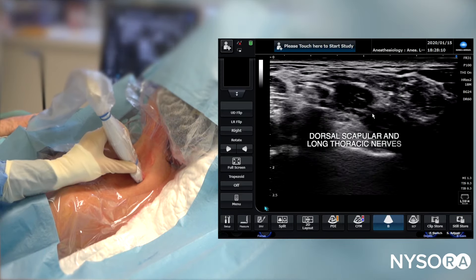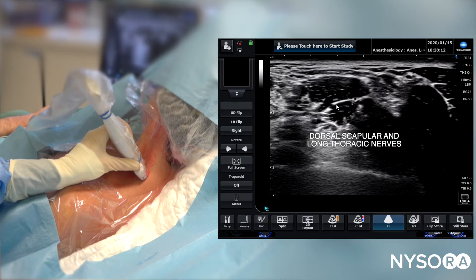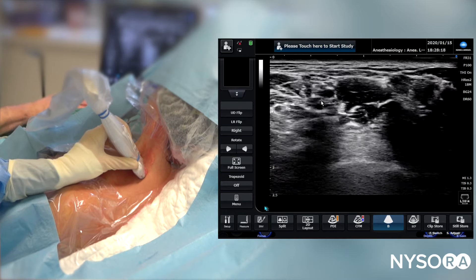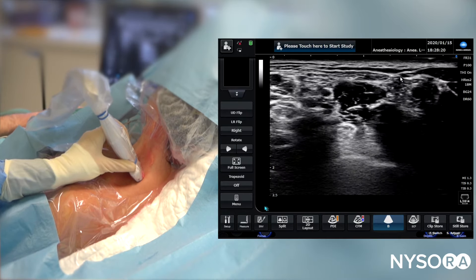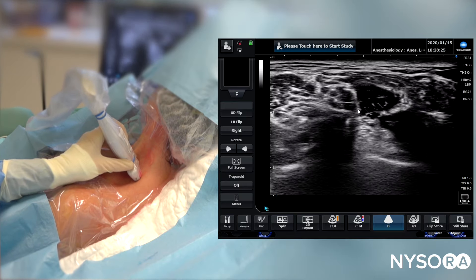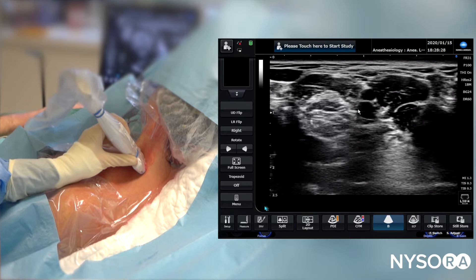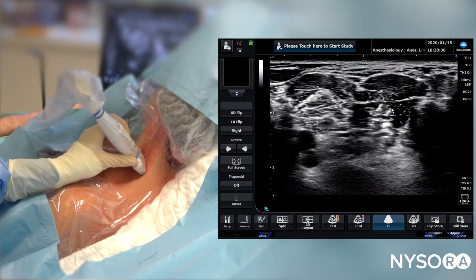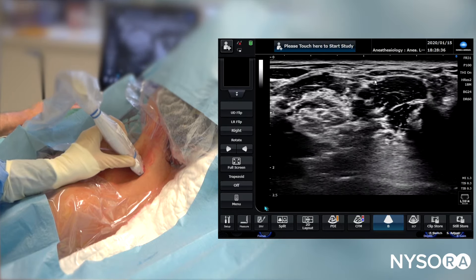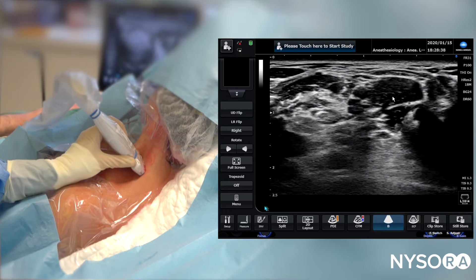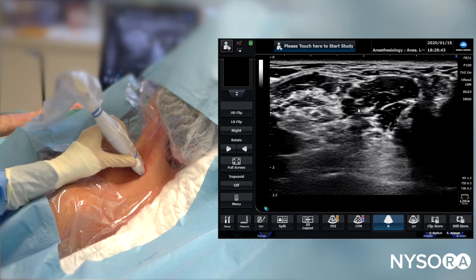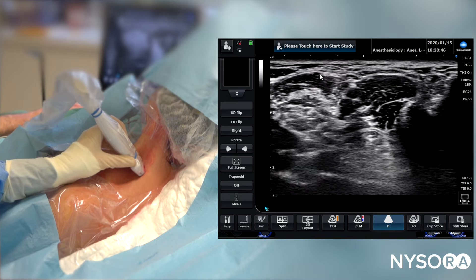This is the dorsal scapula nerve right here in the body of the middle scalene muscle. This is one reason why we routinely use nerve stimulation — because if a needle encounters the dorsal scapula nerve, there could be elicitation of an unexpected distal motor response of the shoulder, which allows one to stop further advancing the needle and avoid damage to the nerve. We now have our target image: middle scalene muscle, anterior scalene muscle, the interscalene brachial plexus space, and the phrenic nerve underneath the anterior scalene muscle.